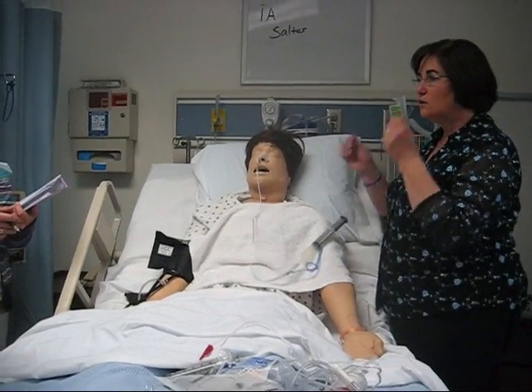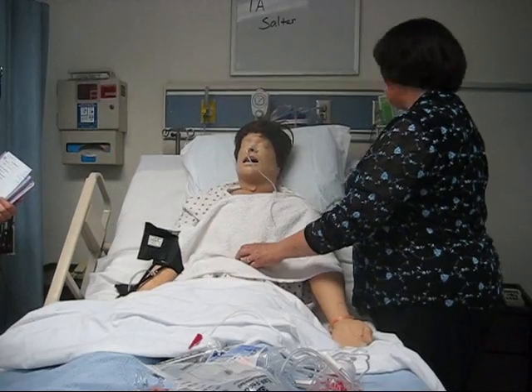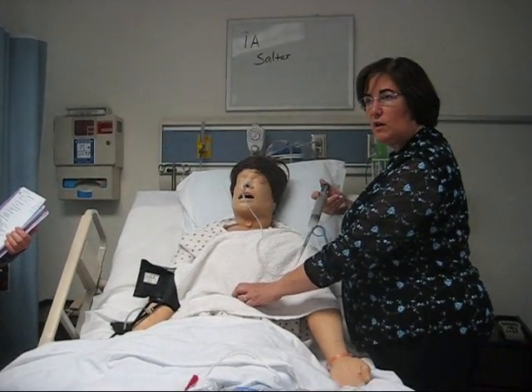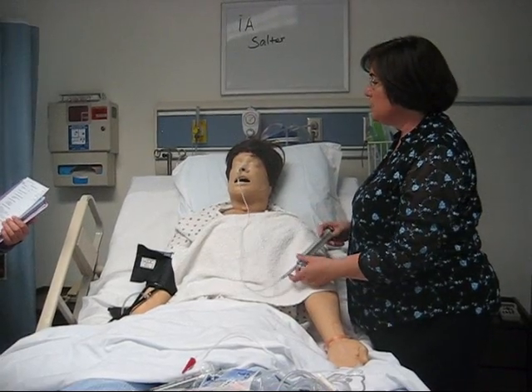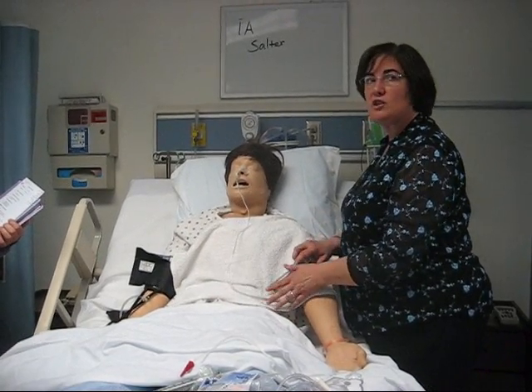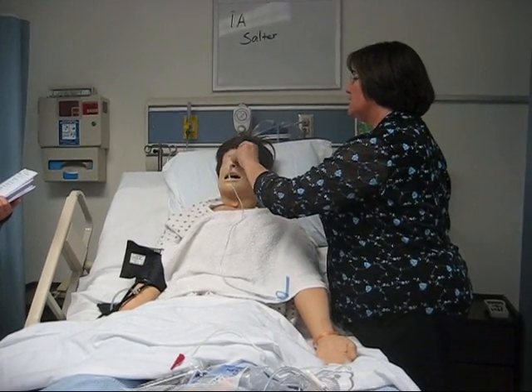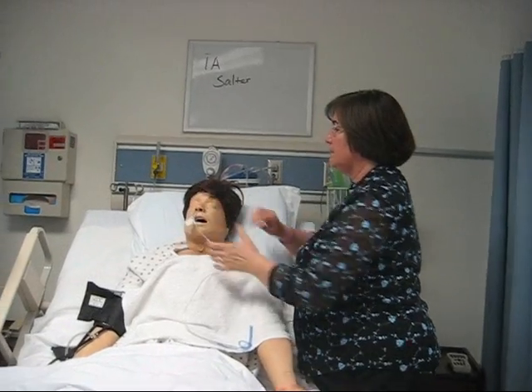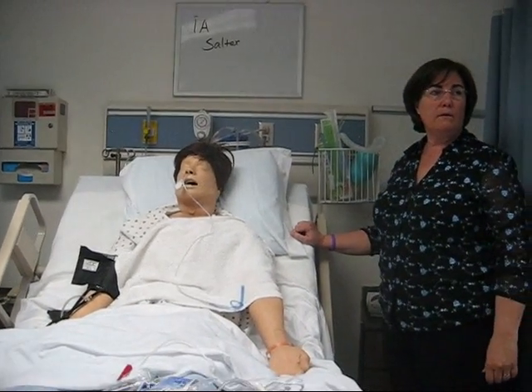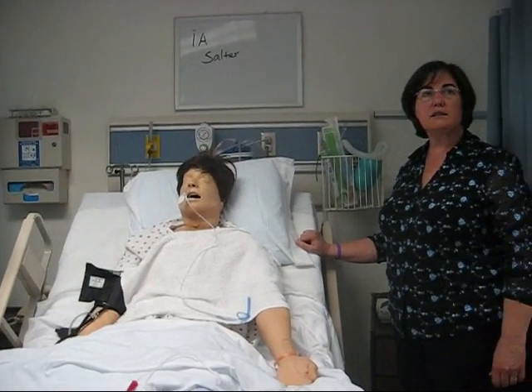And then the other thing I could do is put my stethoscope on, right here, and do the insufflation where I put air in and I listen. Also not a very specific sign. But we'll see people doing that. But why don't I just start by looking at the patient. And if I came along and what I saw was this, and you know it moved. Yeah, exactly. It moved. All right. So I could stop right there.